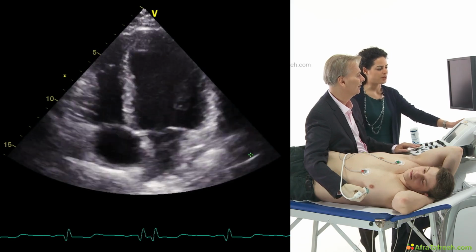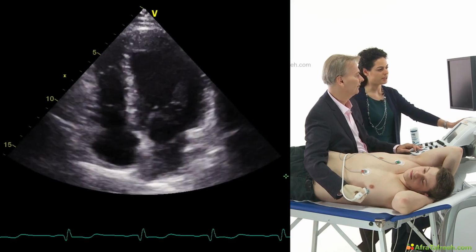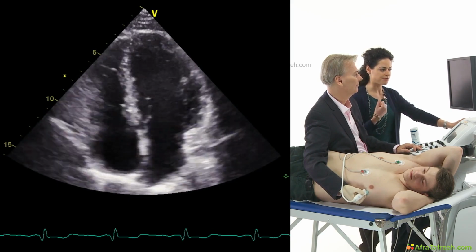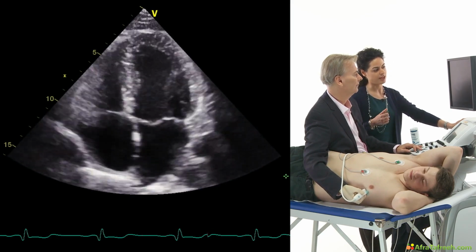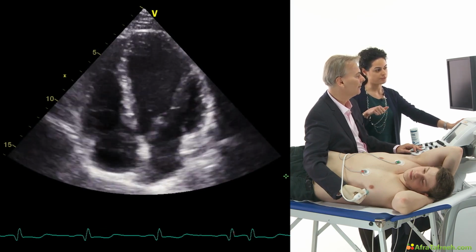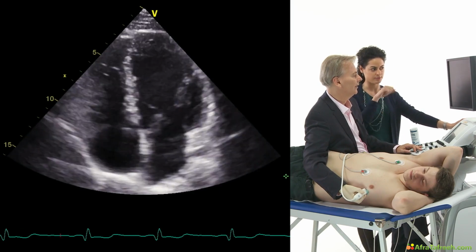What I really like to do in my patients when I analyze the mitral valve is, again, after performing the parasternal long axis view with the tilting, I do it again here. So I focus on the anterior part. Yeah, I'll show you this.